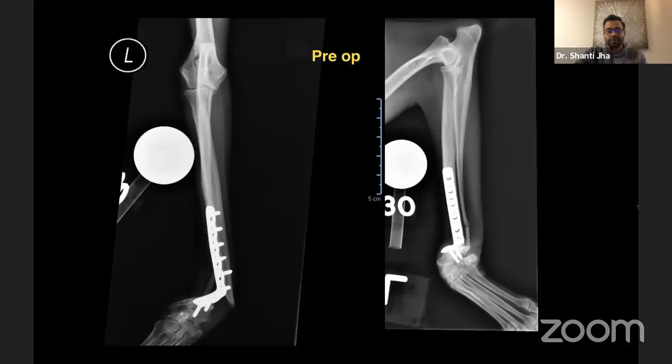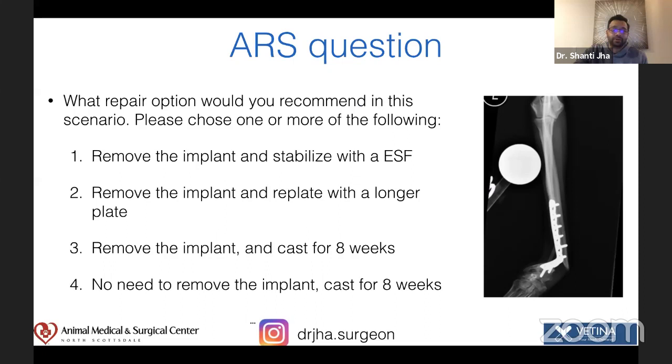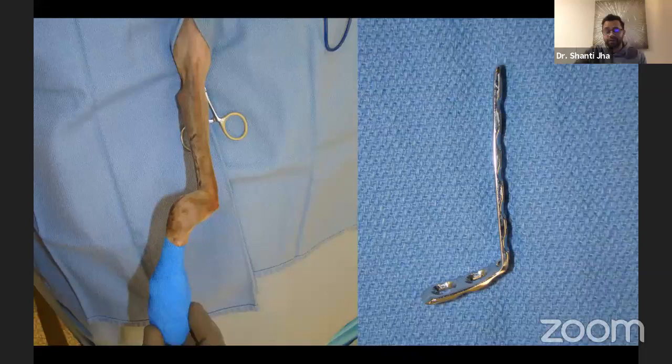What would you do here? Well, the answer is pretty simple. You remove the implant and put another plate, okay? So I removed the implant, so here you go. The plate was frayed beforehand, and now it's an L-shaped plate, so the implant is removed.